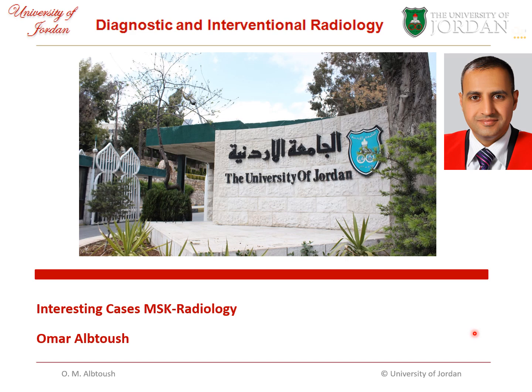Today I will talk about an interesting case in musculoskeletal imaging. It's also very important for general radiology. So we will have a look.